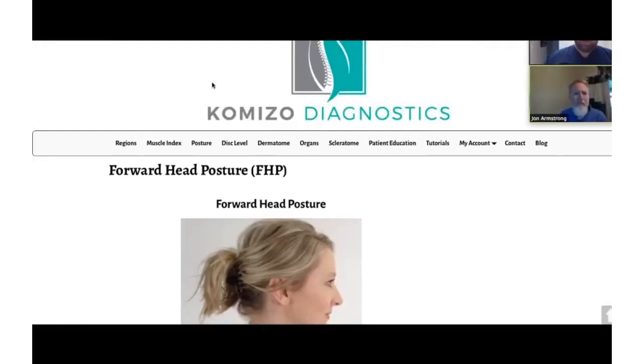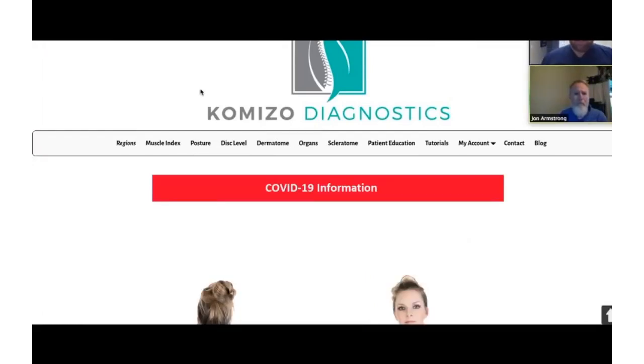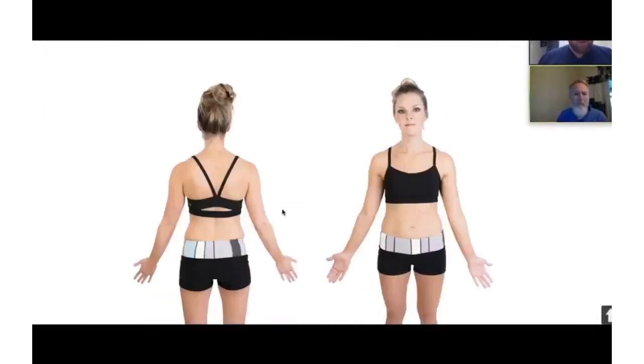So let's start from the beginning here. Just help me isolate where your pain is. Do you see my picture there? I do, yes, sir. Okay. And can you see the different regions, how they highlight? Yes. Okay. Is it right or left side? More right side. Okay, so I'm going to select this area.